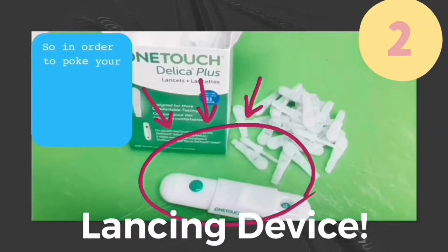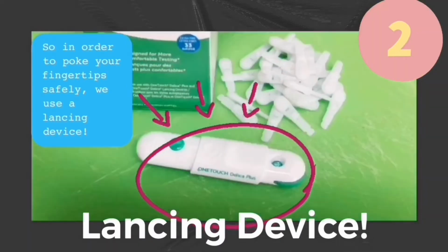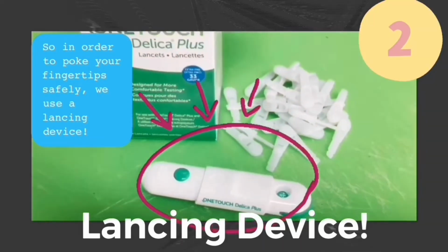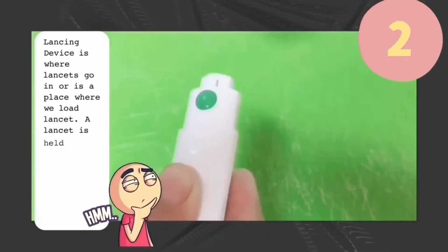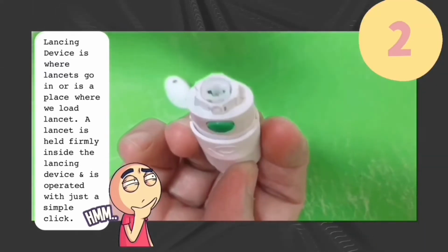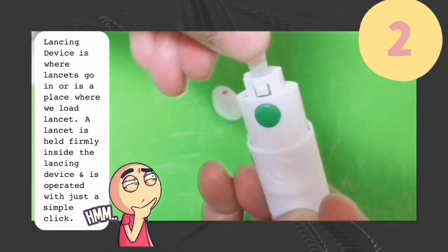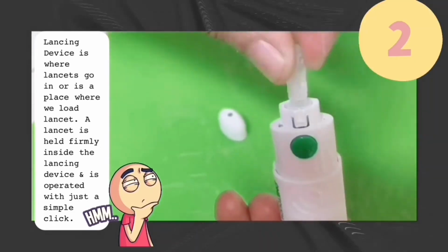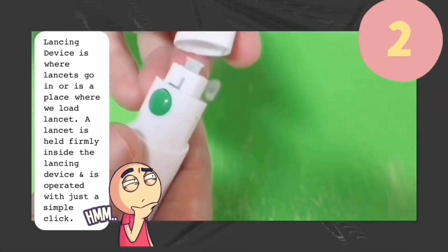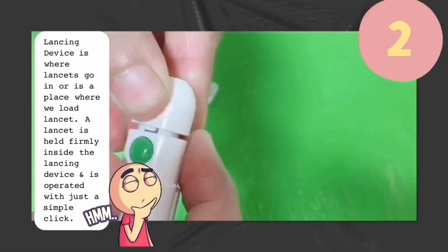So what is the second thing we're gonna need? So, in order to poke our fingers safely, we use a lancing device. So what exactly is lancing device? Lancing device is where lancets go in, or is a place where we load a lancet. A lancet is held firmly inside the lancing device and is operated with just a simple click.